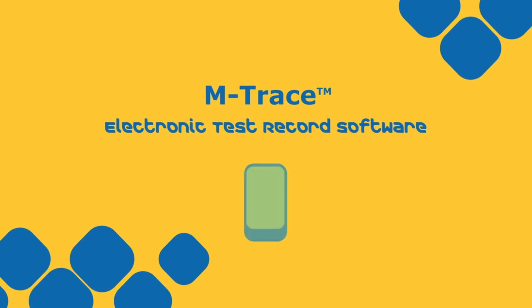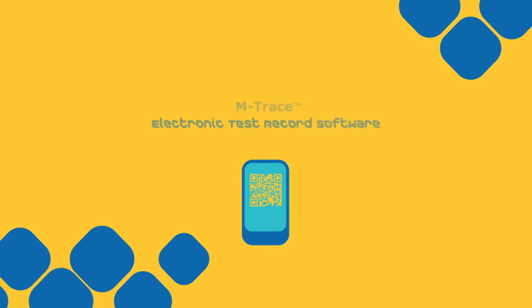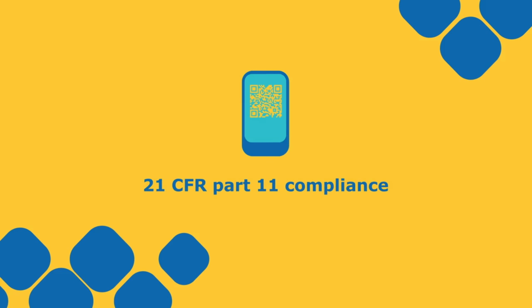The M-Trace Electronic Test Record Software. Your digital QC companion for trusted and efficient data recording. Automatizes and digitalizes your sterility testing and QC testing data in full compliance with 21 CFR Part 11.